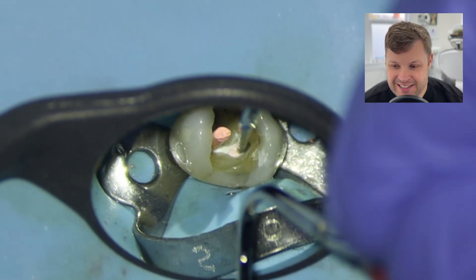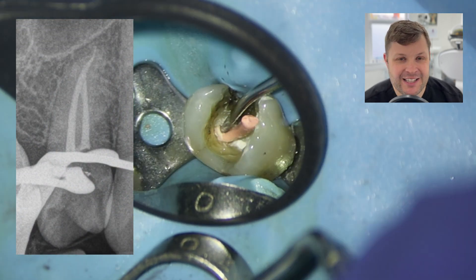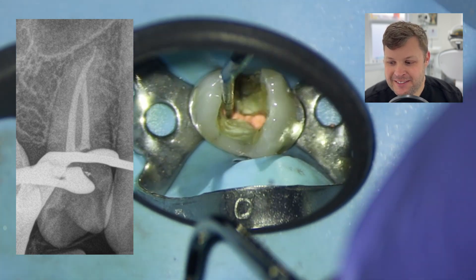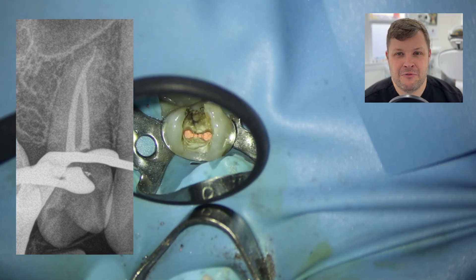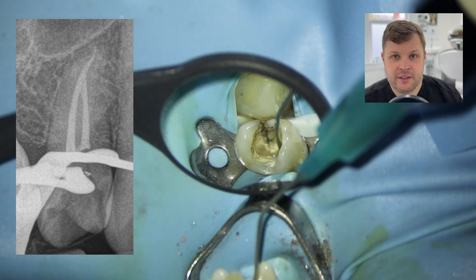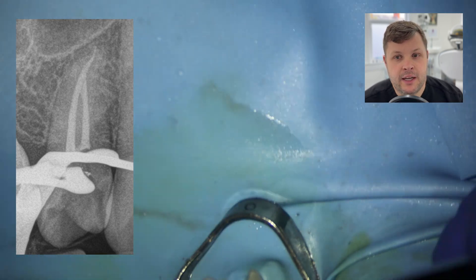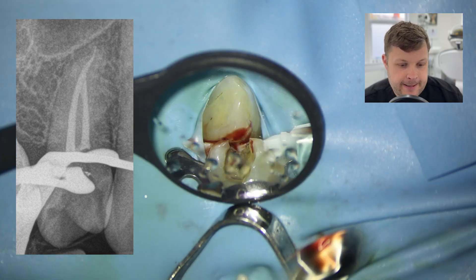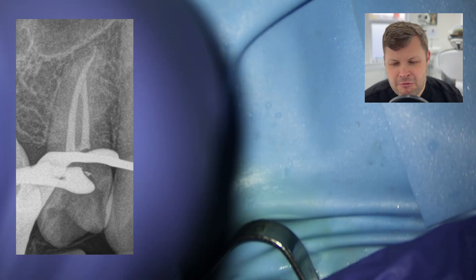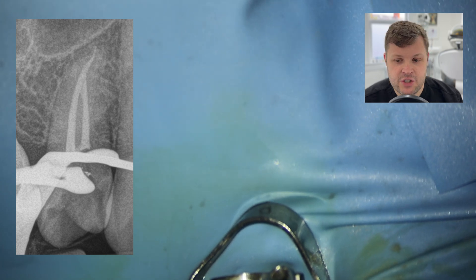I get all the GP pushed into the canal space and get the sealer into all the nooks and crannies. Looking at the final radiograph — this was done last Friday and it looks gorgeous. You can see the obvious join, the anatomy of the tooth has been filled up beautifully, and there's this beautiful S-shape right at the end where the sealer has just gotten into all the apical anatomy. A really, really nice result.